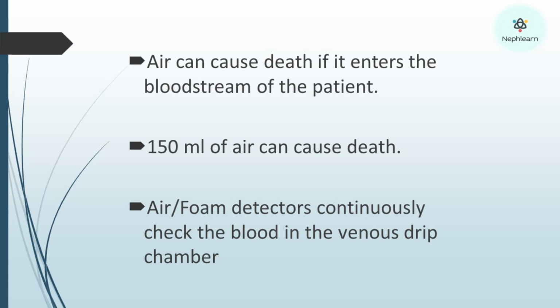Air can cause death if it enters the bloodstream of the patient. 150 ml of air, if it enters, can cause death. Air and foam detectors therefore continuously check the blood for air in the venous drip chamber.